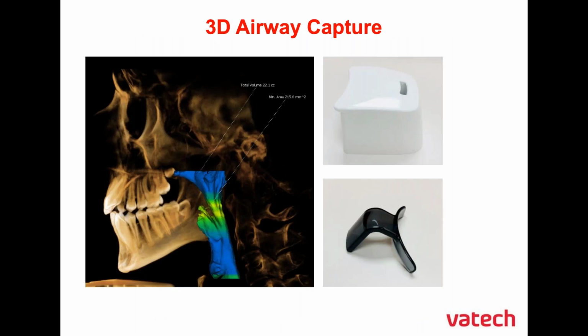it's really simple. We're just going to use that same lower chin cup with the large chin rest in there because we want that natural airway position. So we'll use that with a large chin rest, have them right up to that rest, and stay still for that. Yeah, so those two go there.